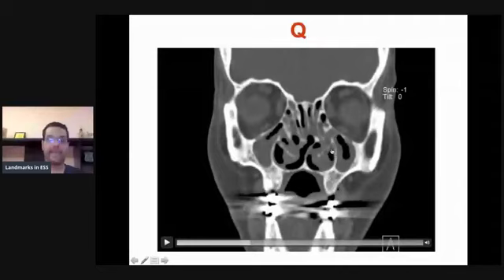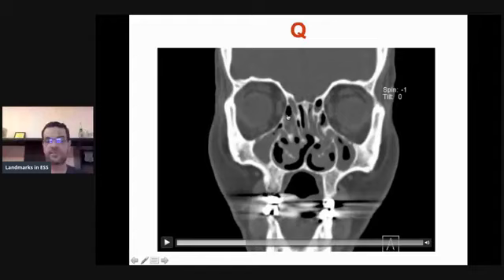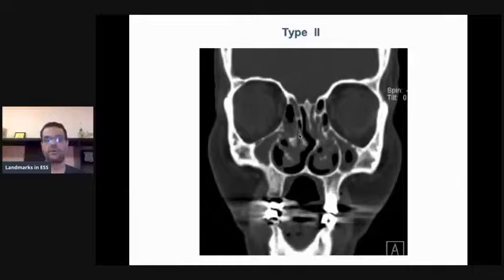And the answer is, it's type 2, obviously. And the reason is we have a hypoplastic maxillary sinus, and then you see the lamina papyracea lies more or less in a medial plane, as you see, it's also clear on this side. See the lamina lies medial relative to the middle meatal antrostomy or the attachment of the inferior turbinate. And then you have very narrow anterior ethmoid air cells, and you can enter into the lamina papyracea very easily. So it's type 2.